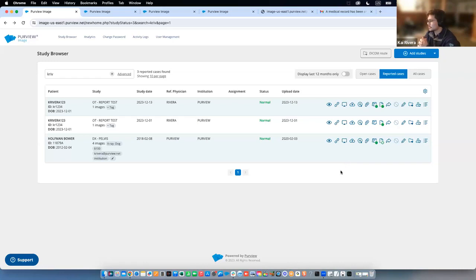While we wait for some of those questions to come in, I'll talk about some of the common questions that I get asked. So in terms of uploading, like I mentioned, you can upload right from the machine. You can connect your imaging modalities right to our cloud server, and we'll work with your modality vendor, technicians or engineers, or somebody from IT to make sure that it's connected to the cloud securely and that you can view them online.